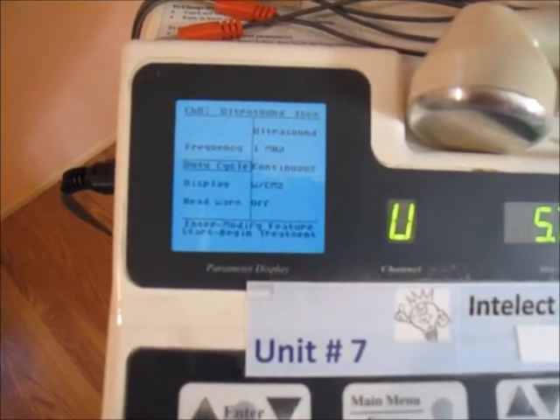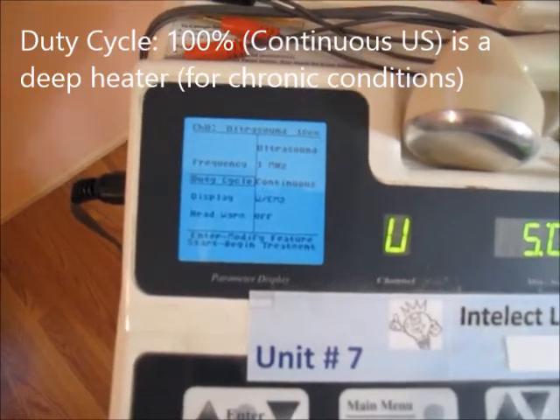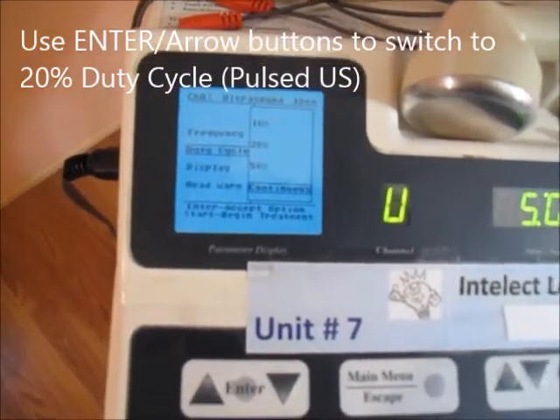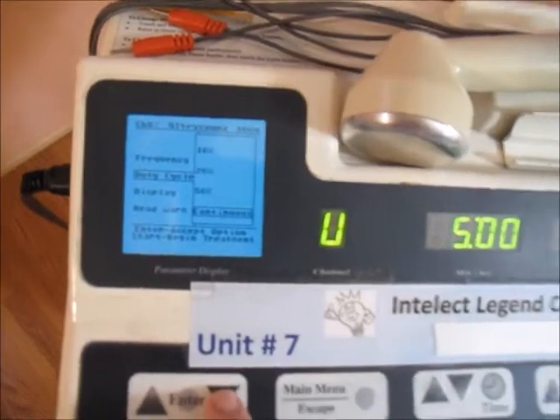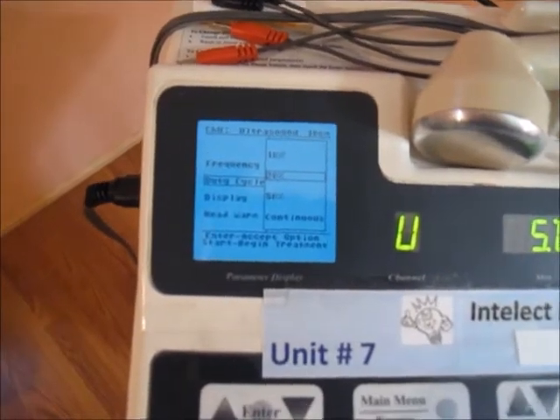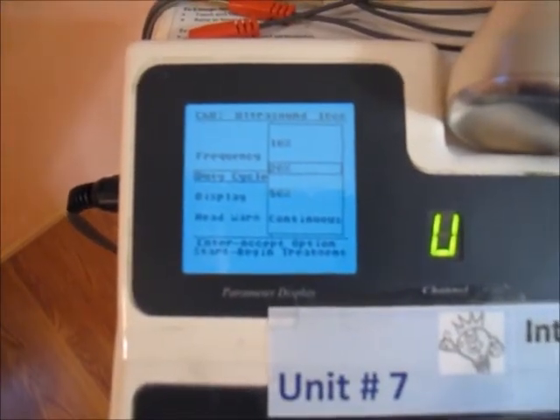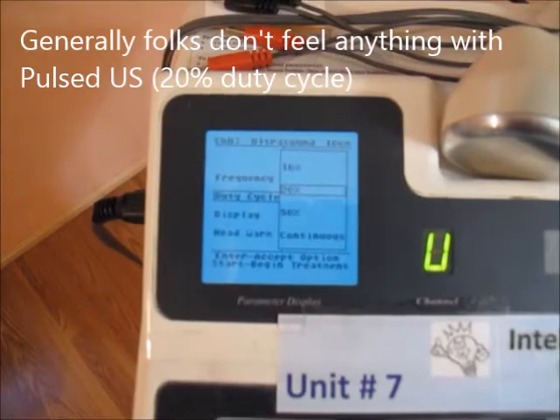The duty cycle you will use will be dependent upon what you need. A duty cycle of continuous means it's on 100% of the time — it's like a full-time job. Toggle this and it switches to different choices. The only other choice you will use will be a 20% duty cycle. Arrow down until you get to 20%. 20% will be the setting for when you're using pulsed ultrasound. Pulsed ultrasound is used for helping connective tissue heal.